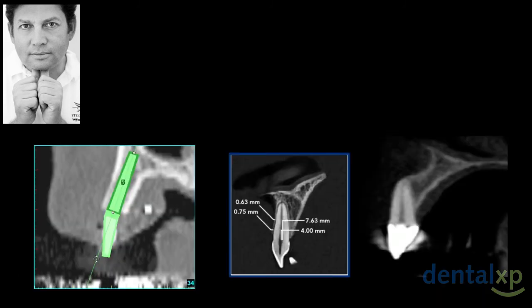There is one scenario where you can place your implant, and with an angled abutment of 15 degrees, you can correct that position. Then you have other situations where you can place the implant slightly to the palate. That's also a good situation. But you have situations where if you follow the bone, you will have tremendous problems. This is an Angle class 2, subclass 2, okay, prosthetic angulation.